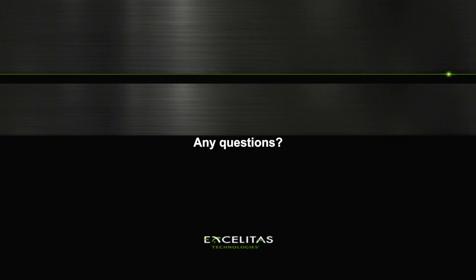Okay, next question. What is the accuracy of the ear thermometer? The ear thermometer must be better than 0.3 degrees C in laboratory conditions. What comes out worse in the application is the medical correlation between the ear and the body core temperature. So when you compare the ear reading to a rectal measurement, you can easily be off by 0.5 degrees C.